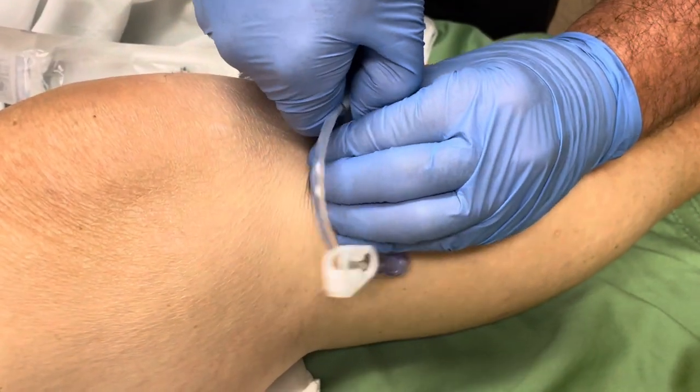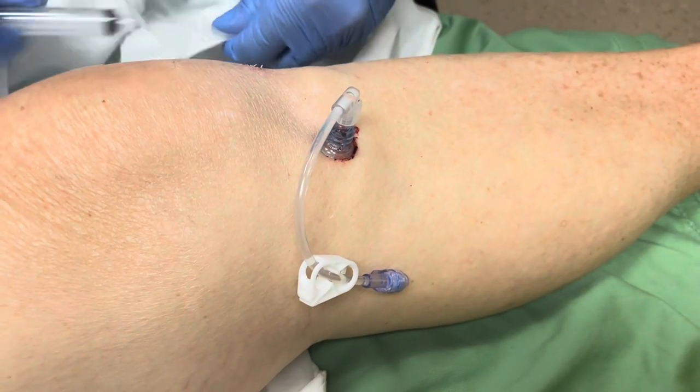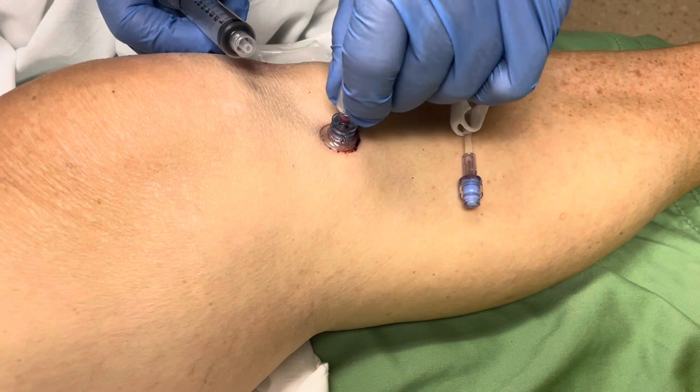First, loosen the pigtail catheter from the hub — this will stop the bleeding, as sometimes they do bleed. Then attach a 10cc syringe.